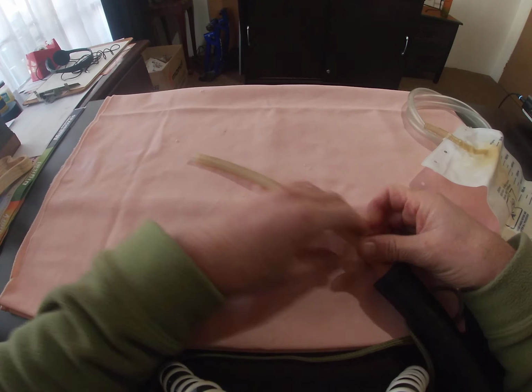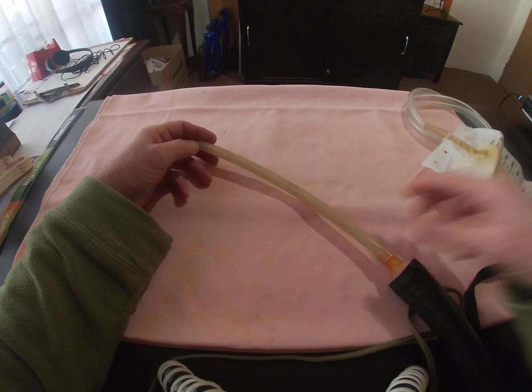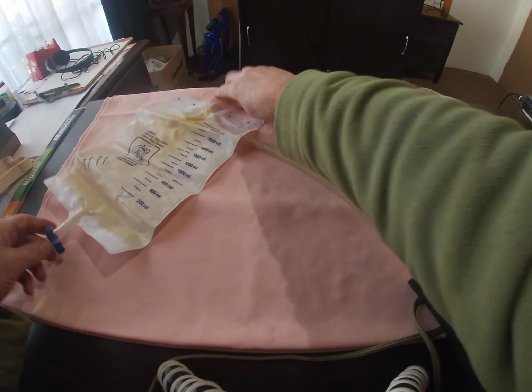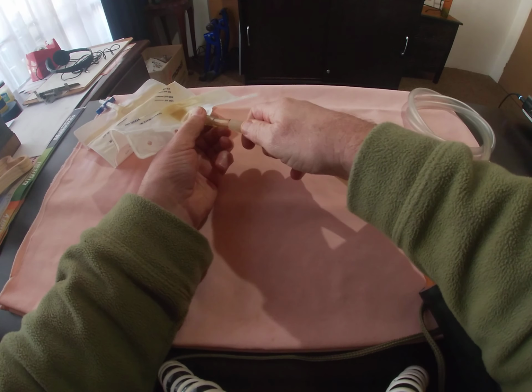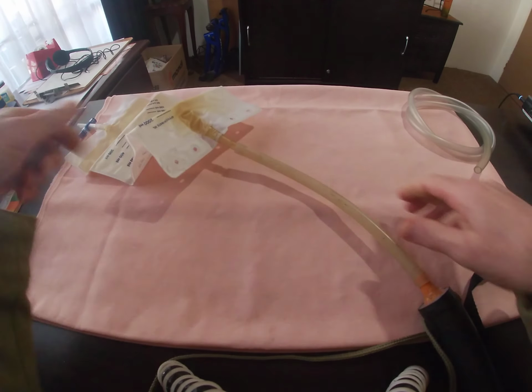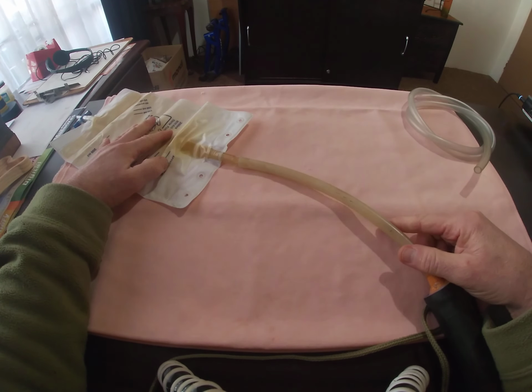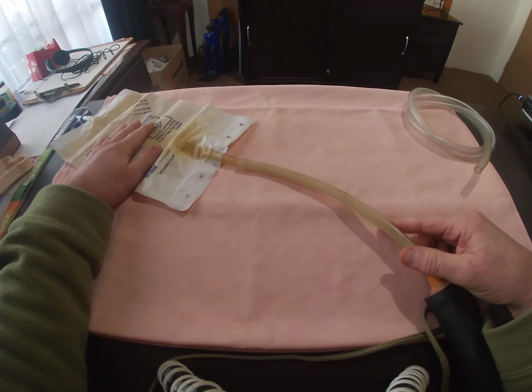how long this is gonna be is also gonna depend on how tall you are. That will determine where the bag is. Now I had the bag on my calf. I preferred it to sit out there so that the flow would work much better, because it was down low. But you can have this on your upper leg if you're gonna go to the shops. If you're gonna sit a lot, I think it's better sitting on your calf or on the floor, as it just makes the flow better.